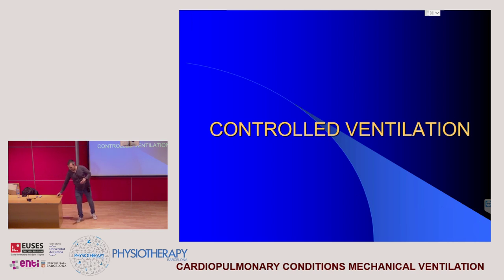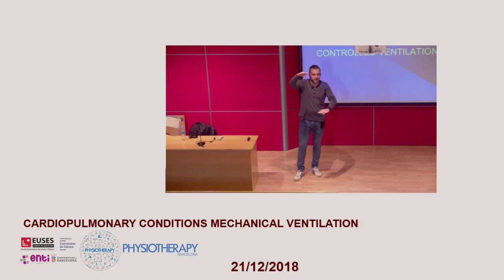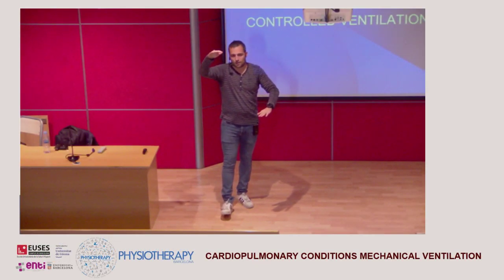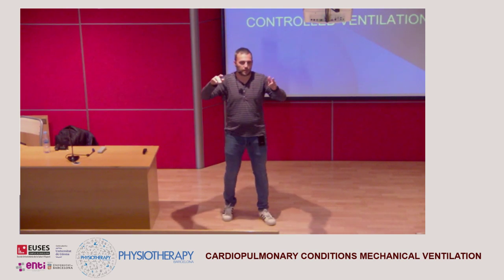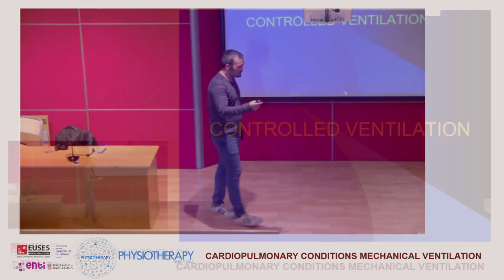Let's say that at the beginning the ventilator work is like that, and the work of the patient is like that, and with the passing of the days and the evolution of the disease it goes that way. Finally the objective is that all the respiration work has to be performed by the patient and not by the ventilator, with the objective to extubate, to get out the tube.